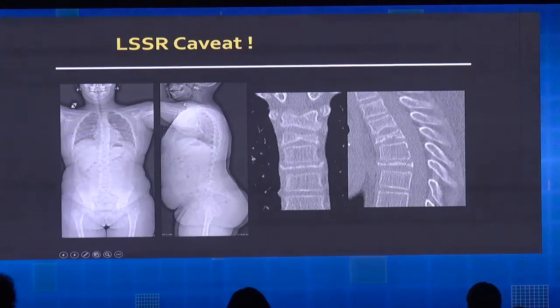So the patient has 2 vertebra plana. I missed them. Okay? And it's something which is even more important when they ask for a repeat, because frequently for the repeat they ask for a microdose, where the dose is even 10 times lower than for the initial imaging, and you end up having some difficulty sometimes to see the bone limits.